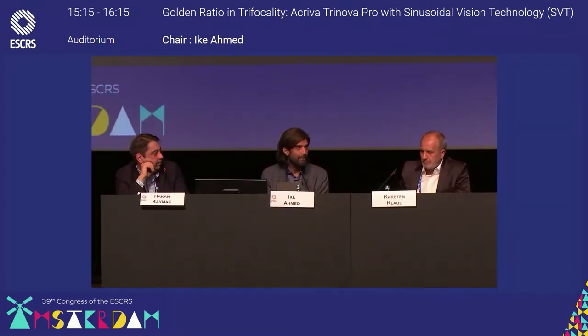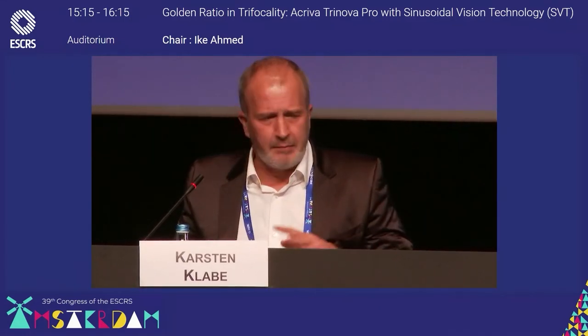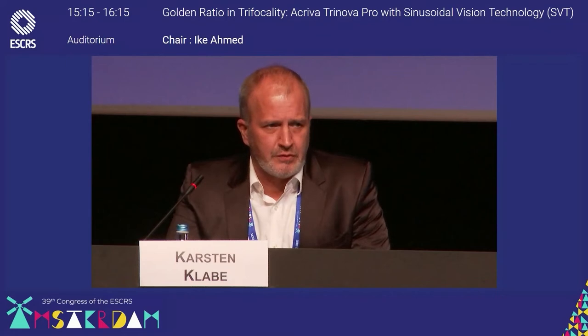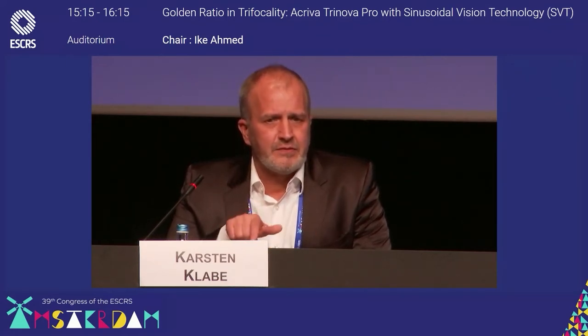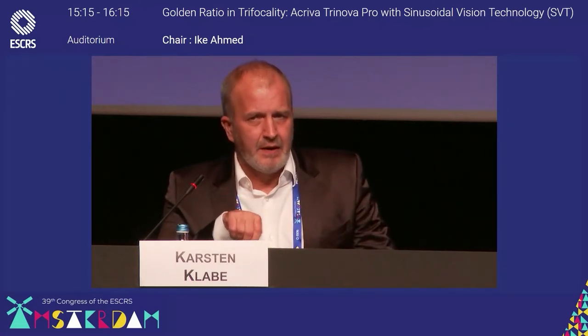Okay, the third one was what injector are you using? Are you having any challenge? Or what are your thoughts on that? So I still stay on the conventional Medicel shooter system, as you've seen in the video. I tried a couple of different things, and I feel fine with this. It fits to 2 millimeters, and my incision size is 2.2, so it's excellent. And okay, if you use the former version, it was a little bit more like a plate haptic.